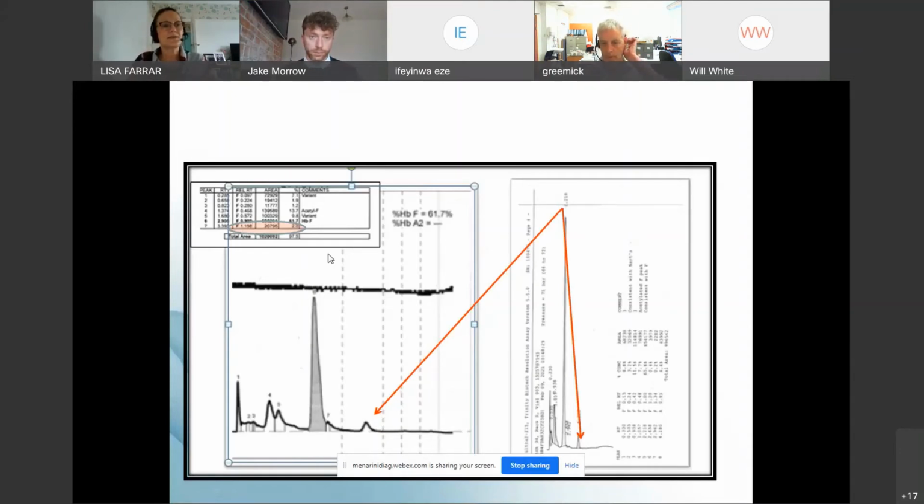So initially, this was a slight concern to us that we would not be able to identify low levels of A in premature babies. But if the same problem occurred with the Primus Ultra, we'd do the same thing as we did with this case. We increased the number of blood spots that we used from 4 to 5. And on the next full quantitation, we found that the analyzer was able to quantitate this hemoglobin peak at 4.5% in line with the Primus Ultra.